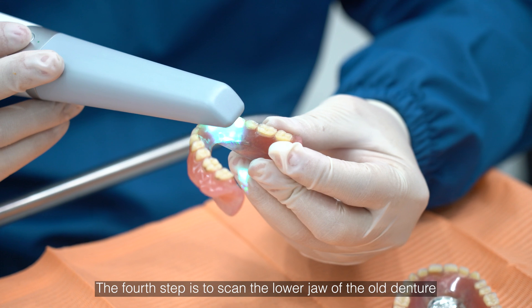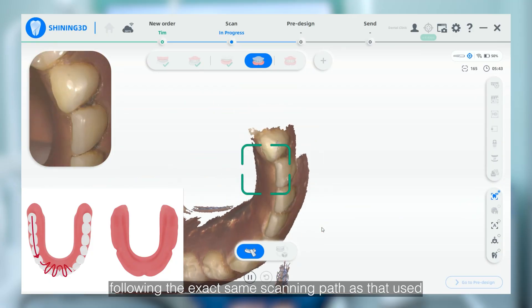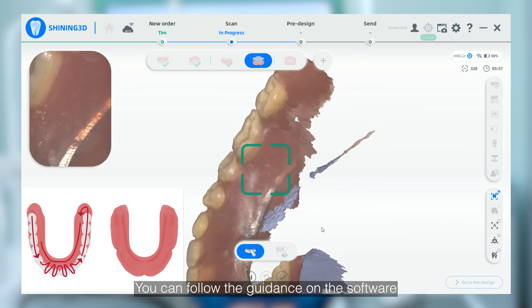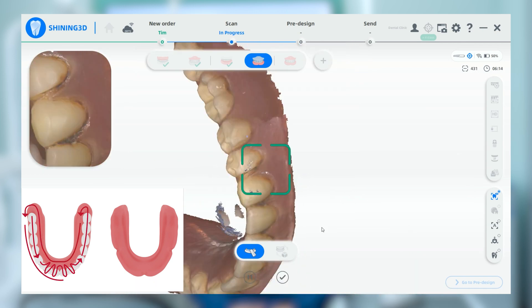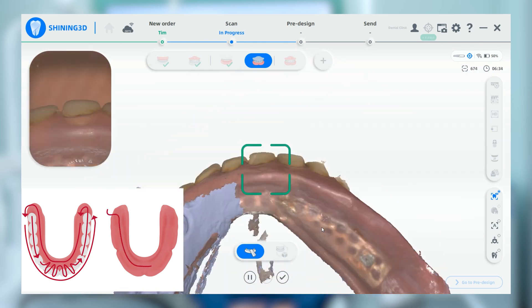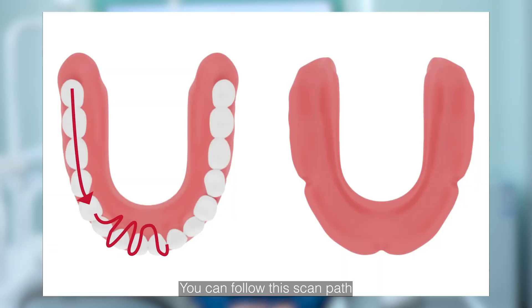The fourth step is to scan the lower jaw of the old denture, following the exact same scanning paths as those used for the upper jaw of the old denture. You can follow the guidance on the software. You can follow these scan paths.